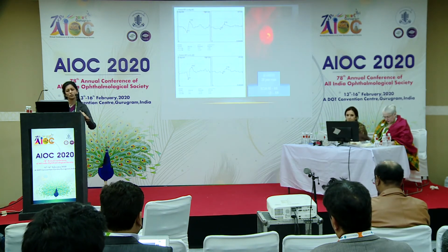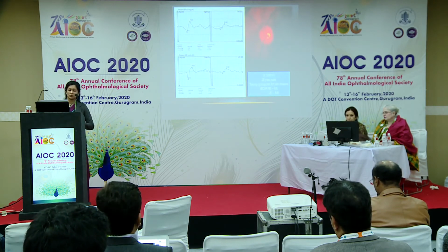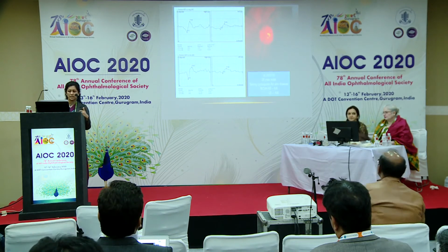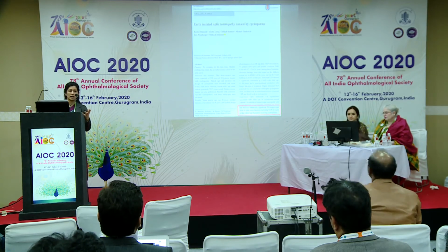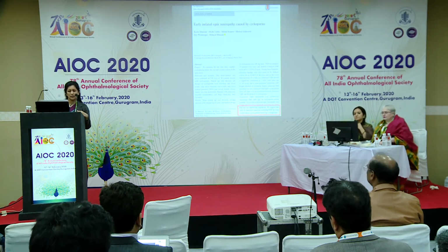Just one thing I wanted to share, which I recently read about when I encountered a patient, is that cyclosporine can cause optic neuropathy. It's a drug very commonly used for skin disease, and I realized this when I was faced with a patient of cyclosporine toxic neuropathy. On reviewing the literature, pattern VEP has actually been recommended as a tool in patients who are on long-term cyclosporine therapy to know when optic neuropathy has started.